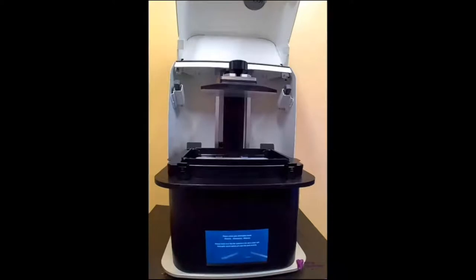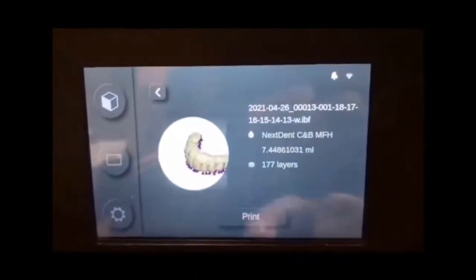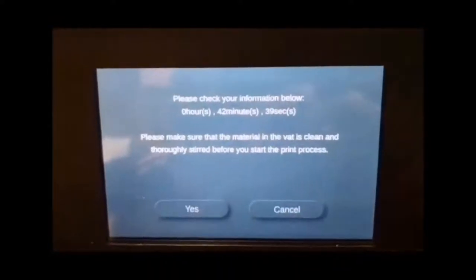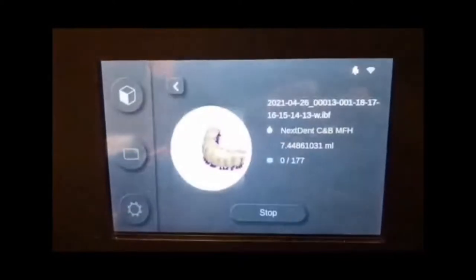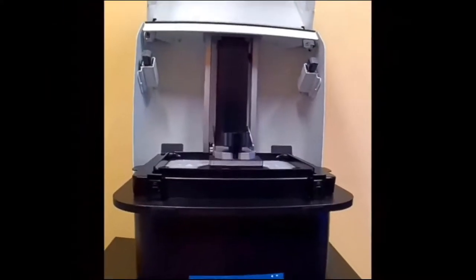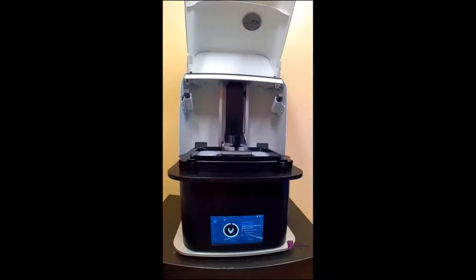Here we'll see a little bit of a closer view of that touchscreen. We see the file name there in the queue. We hit print. It'll show you a visual representation of the model, and then you can just start to print from there. And of course, it's going to ask you also to verify the print. This particular model took about 40 minutes to print, and you can see the printer is going to start. Now, typically, you wouldn't have the cover open like this, but for this time-lapse video, I left it open so we could see the printer in motion. So the platform's not going to be moving up and down quite as fast as you see in this video. This is sped up, I believe, 20 times normal speed.